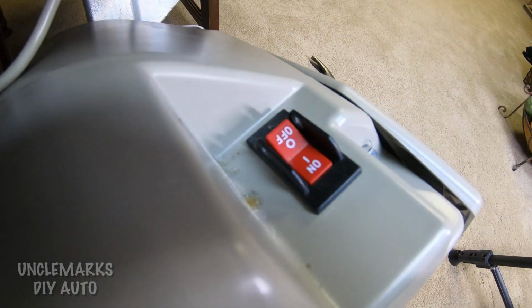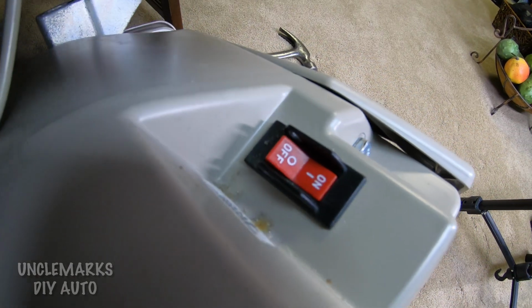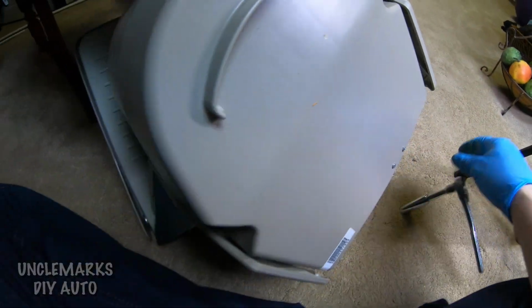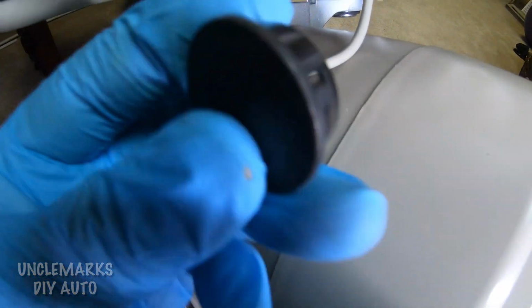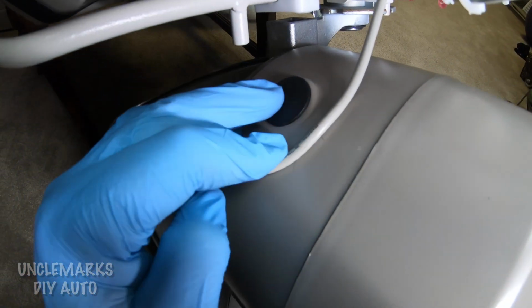Make sure you turn it back on. Hopefully it's working now, and you can have some help going back up and down the stairs. Well, I see I had a plug here that I put back in too. Make sure all your pieces are back.